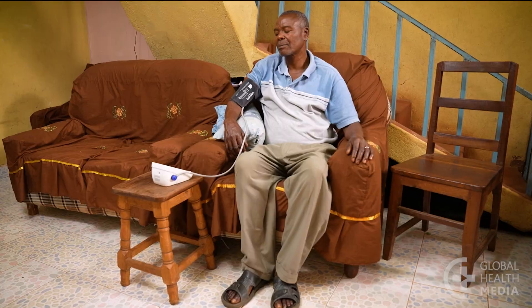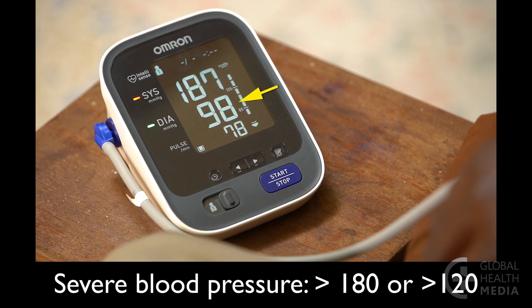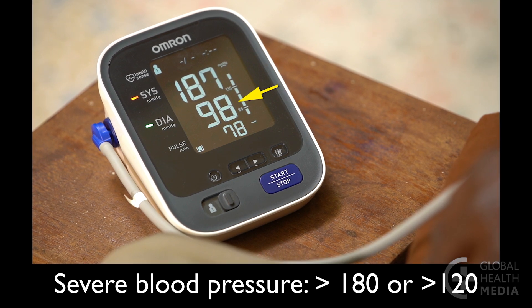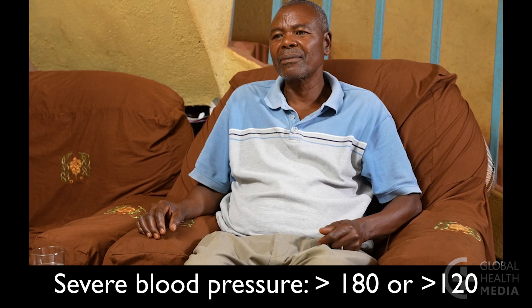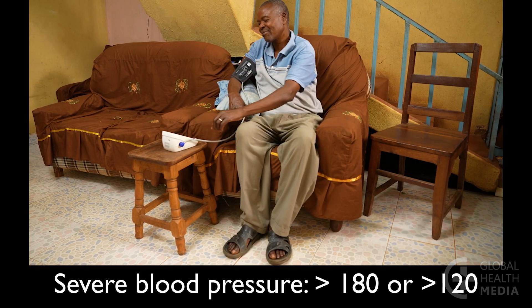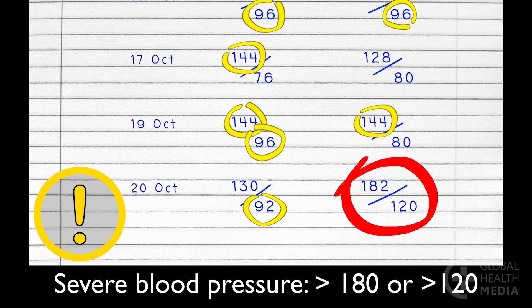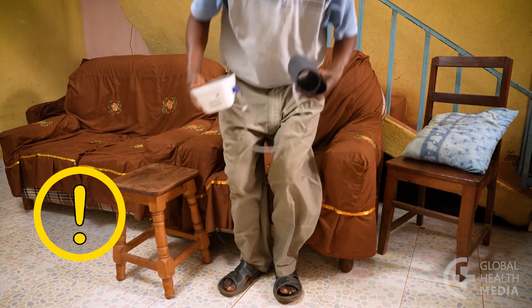If your blood pressure is more than 180 or more than 120, it's too high. Rest, and check it again. If it remains that high, seek medical care right away. Such severe blood pressure can damage your organs.